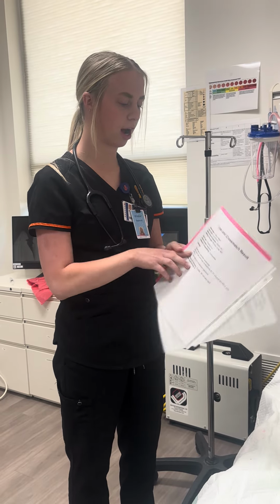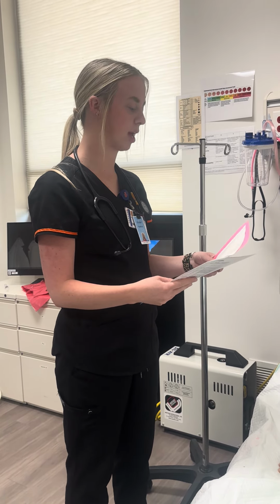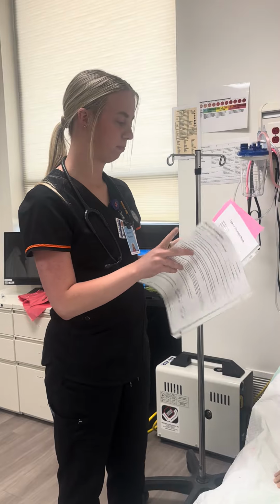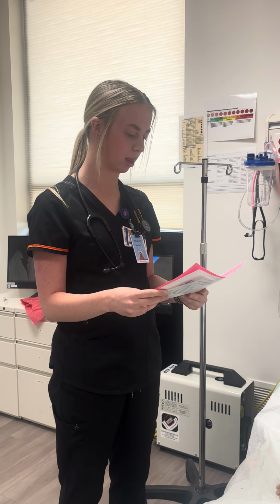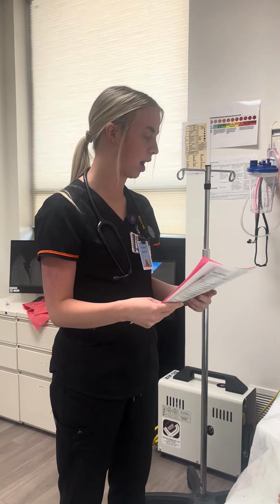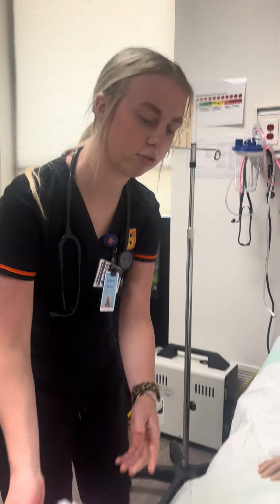So on here, I have that their blood type is A positive. And so I will double check that with the blood bank and make sure that we're administering the correct things. Other than that, I think we're good. So I'm just going to set these here for now.